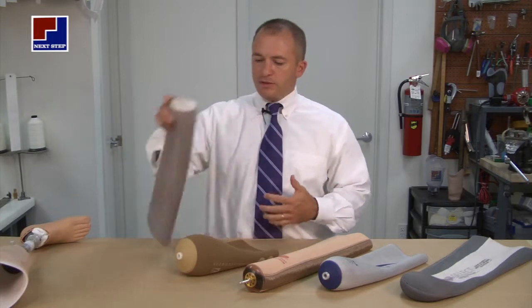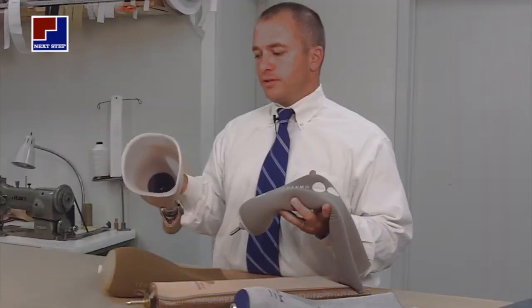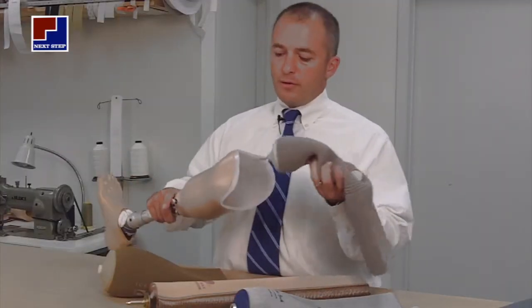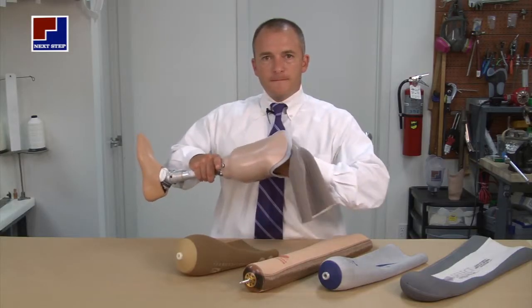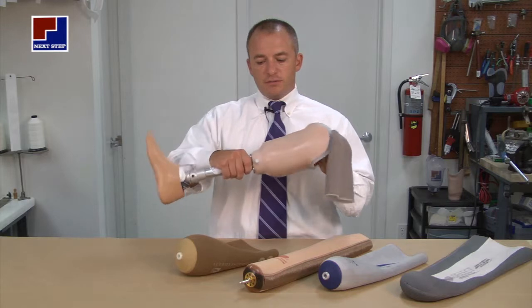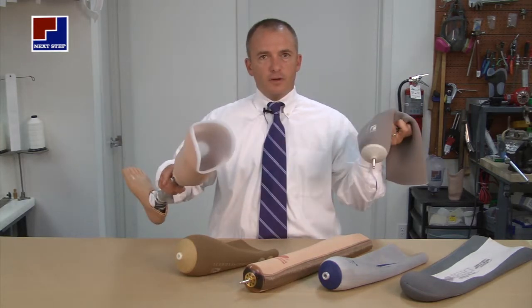When it comes to the pin system and how it suspends the prosthesis, at the bottom of the prosthesis is a lock mechanism. The bottom of the gel liner is a shuttle pin. What you do is click it in and it's suspended. To release the prosthesis, push the button and everything comes apart.